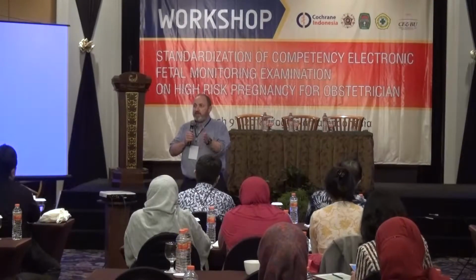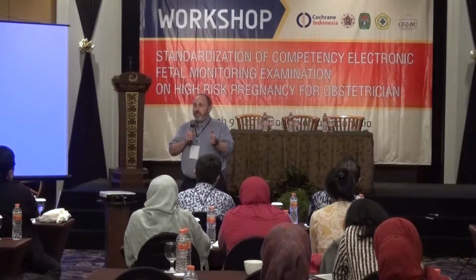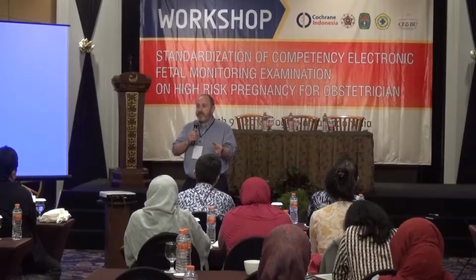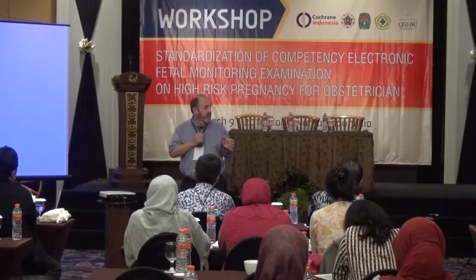That's different to the situation where the head is well engaged, there's good descent, the head is being compressed, and you've got early decelerations.